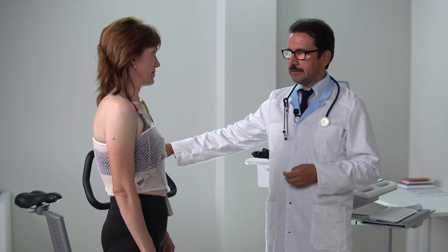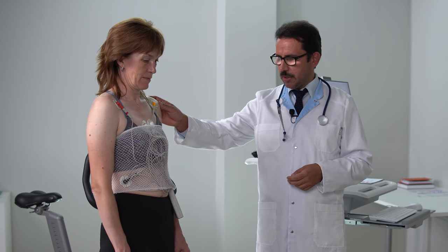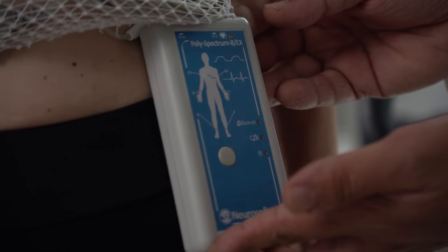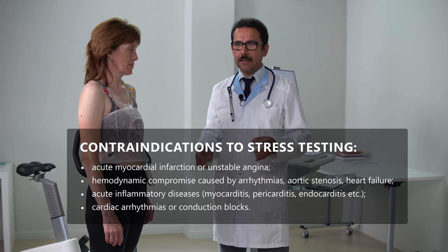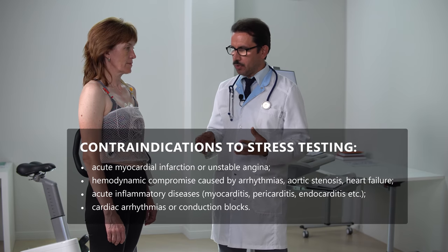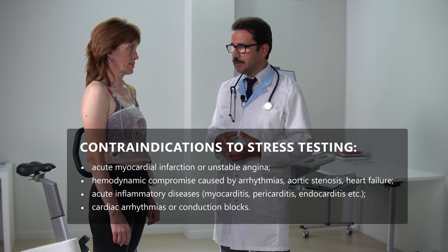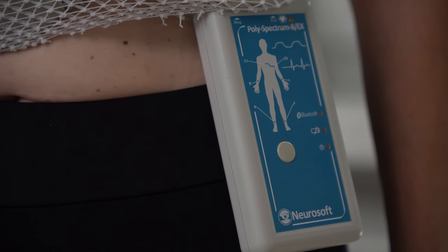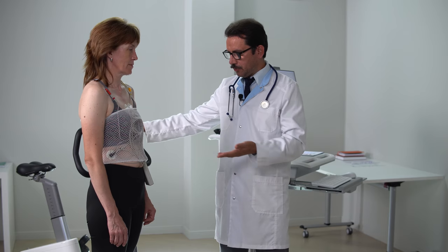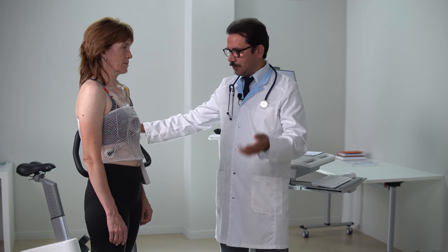to the exercise setup. First, this is the ECG system. Today we are going to use a wireless ECG system, Polyspectrum 8EX. It is a Bluetooth device, and this wireless feature is very important in the exercise stress testing setup because we can allow our patient to move freely in our diagnostic room, for example, to come from a bicycle to a couch for some rest or in case of some emergency. And also medical personnel can work in the room freely without danger of catching the cable of the device under the leg and falling over it.